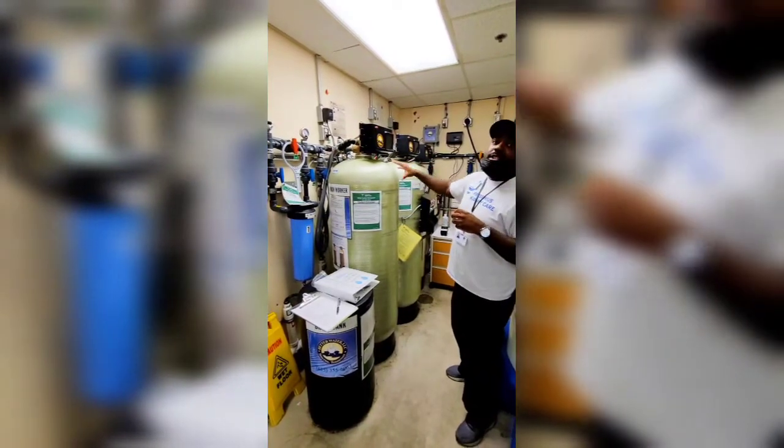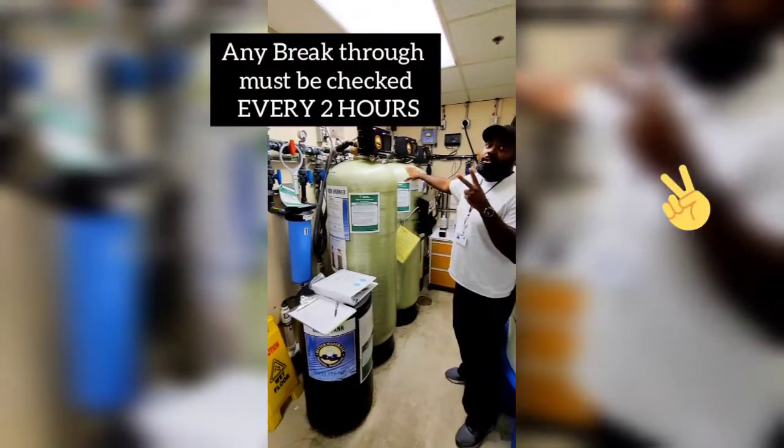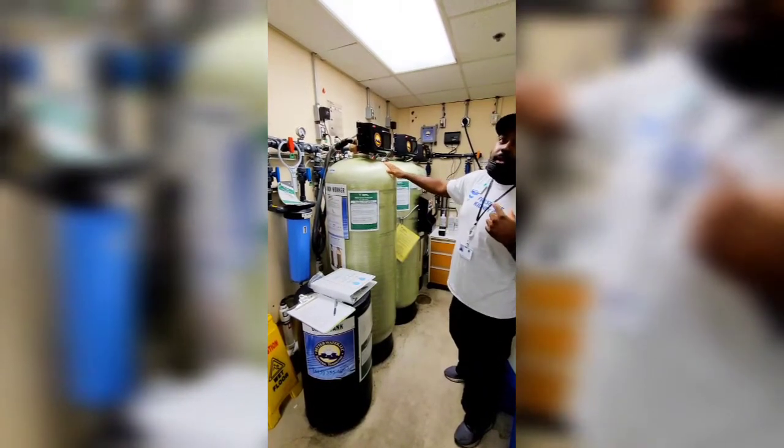Now, if you get to the point where you check the water on this tank and the chlorine and chloramines are too high in there, that's considered a breakthrough. At that point, instead of checking these tanks every four hours, you'll start checking this one every two hours.